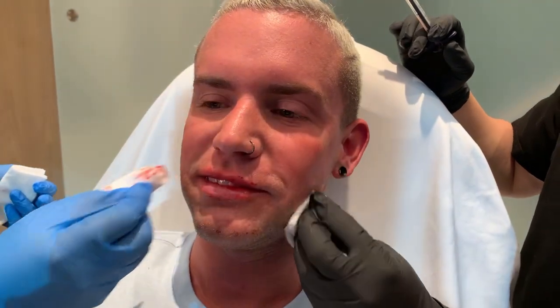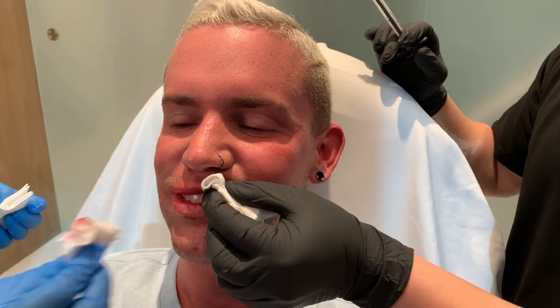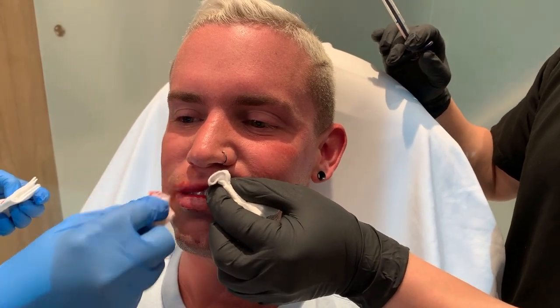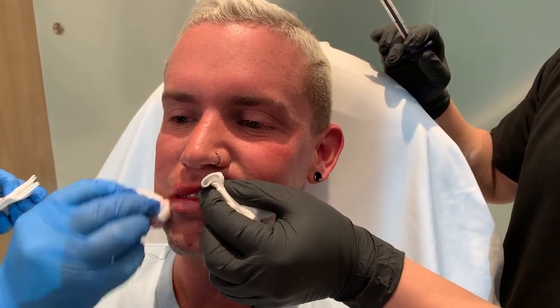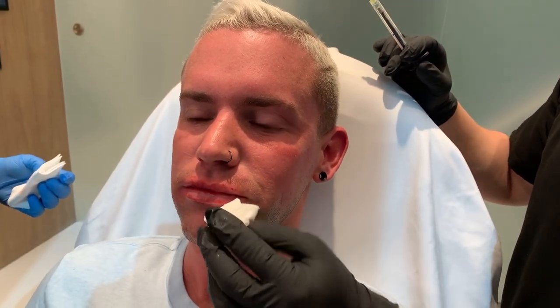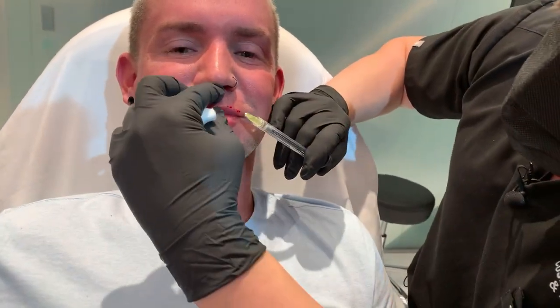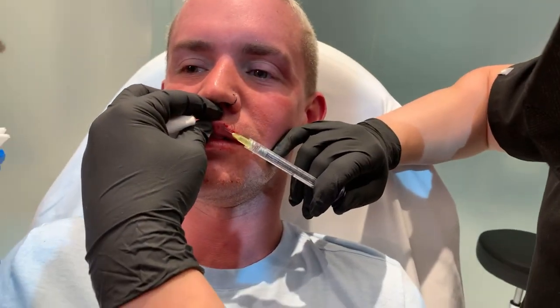Get his eyes, hold on. Close your eyes a sec. Good. Let's let that sit a second. He bleeds easily. It's okay. I'm just gonna let it stop. It's drooling because of the numbing. It's okay. It's alright, don't worry. It's normal.